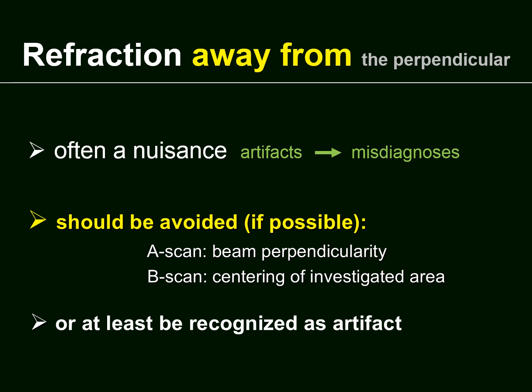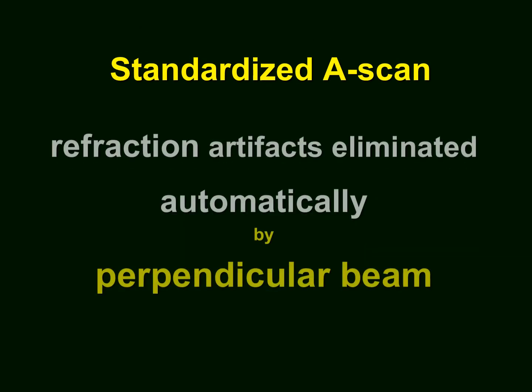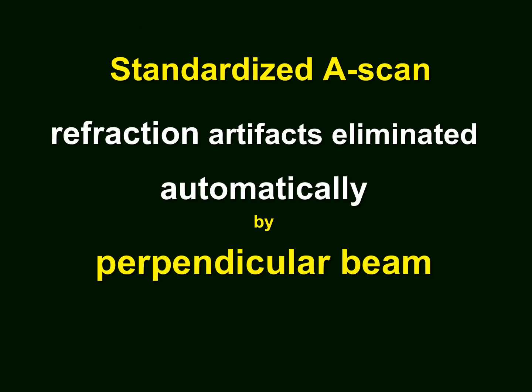At least these artifacts should be recognized, and this way misdiagnosis should be avoided. Again, in standardized A-scan, refraction artifacts are eliminated automatically by the perpendicular beam, which is a must for evaluation of large interfaces anyway.